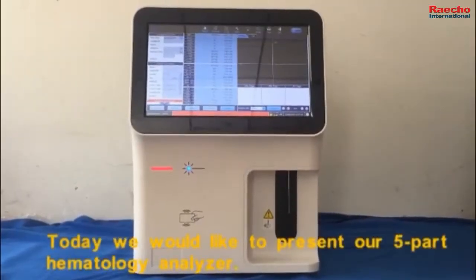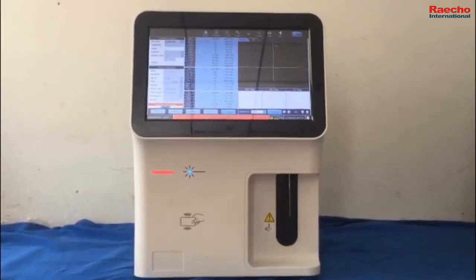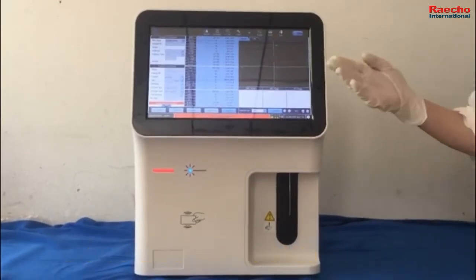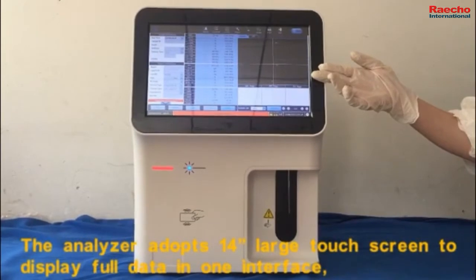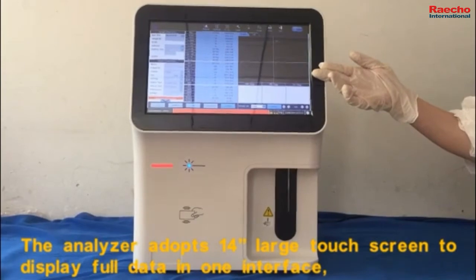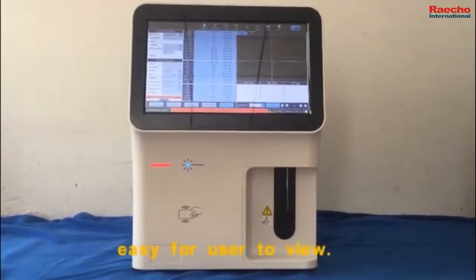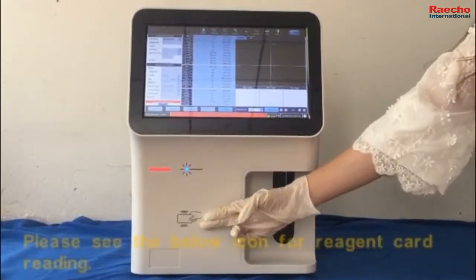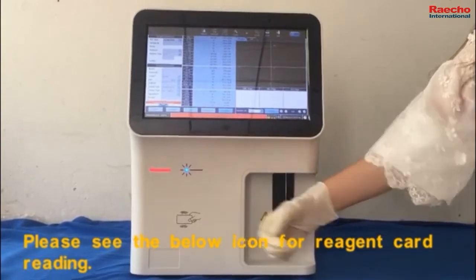Today we would like to present our 5-part Hematology Analyzer. Let me show its base structure. The analyzer adopts a 14-inch large touchscreen to display four data in one interface, making it easy for the user to view. Please see the below icon for reagent card reading.